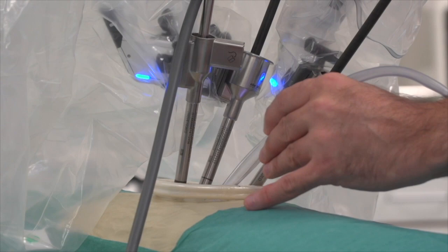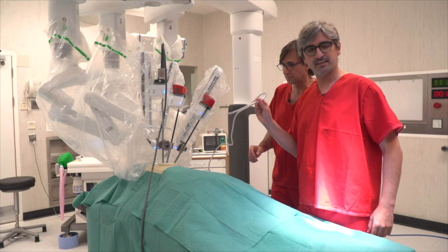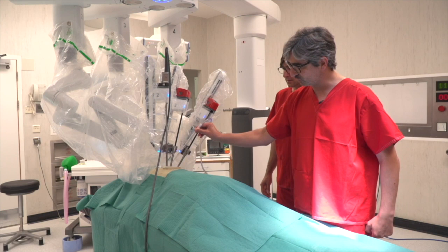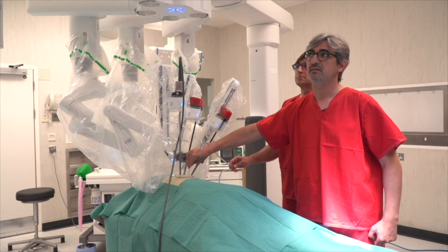One important detail: it is very important that the assistant, in this case Mugur, uses the suction, because the instruments that he uses are only two or three. Long curved, longer than this. Metallic, it should be metallic, one. Long curved suction like this. So he has to see the space to help, okay? To help with this. Very important. To expose, for example, retract the lung, suction, remove the blood or the liquid or whatever.